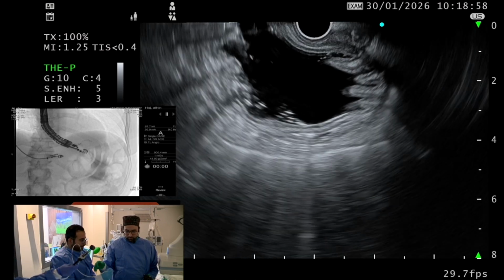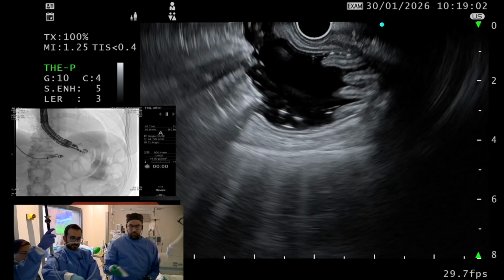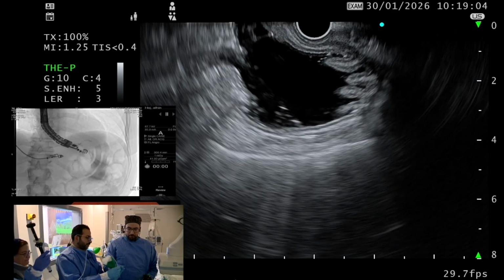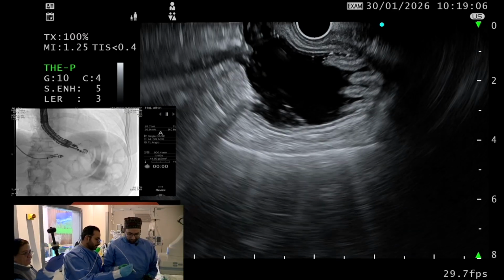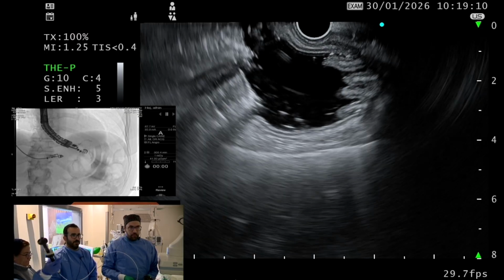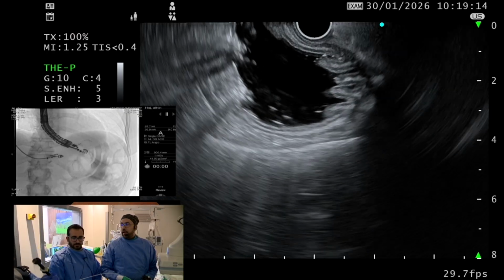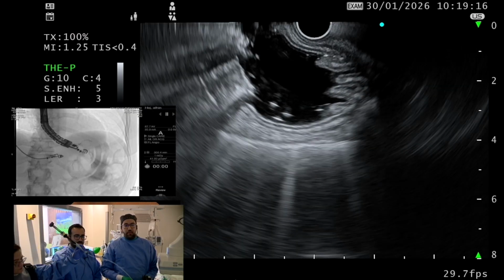So, Nawaf, Adel, what do you think is the cause of the stricture? What is your working diagnosis? Why would a man who had a sleeve, then a bypass, develop a stricture now? So this patient has had a lap chole, and the other issue is that she has leukemia.